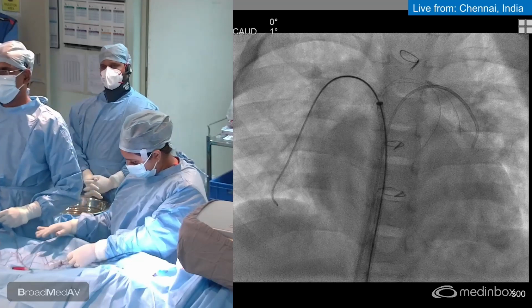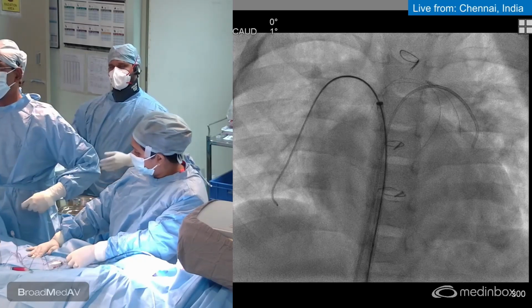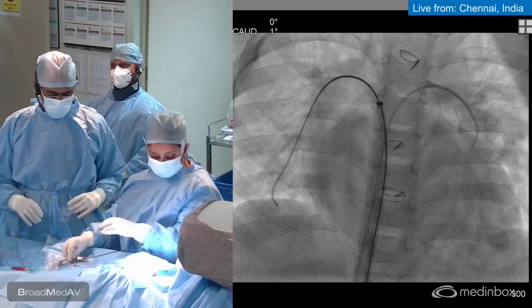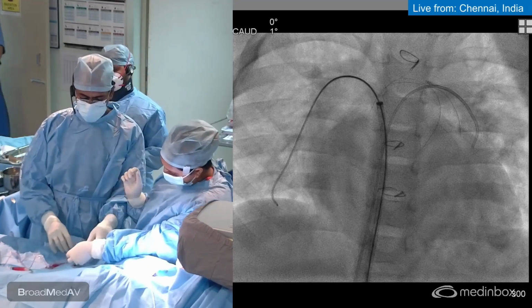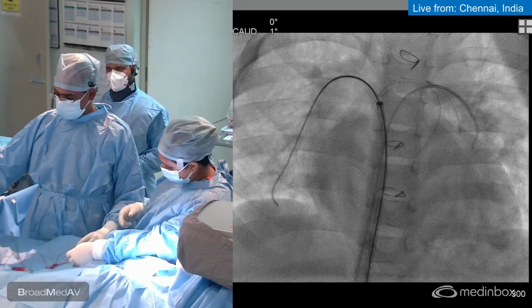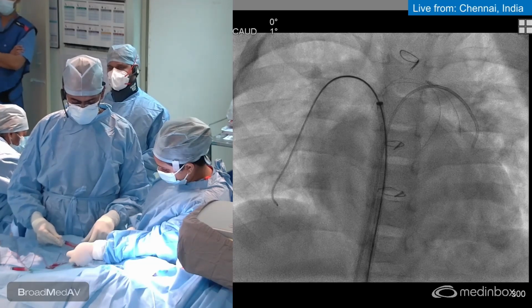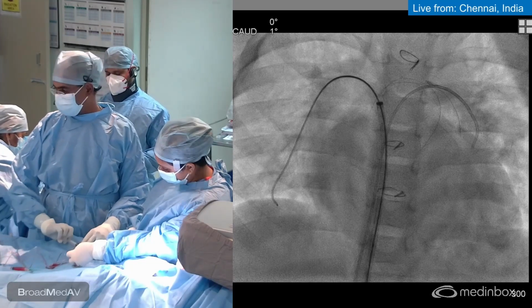Regarding the angiographic projections, we know that in this case the confluence is safe, the confluence is not having significant narrowing. If the confluence was also narrowed, what kind of angiograms would show it better, including the branch case in these cases? One of the challenges that we'll face in the presence of a confluence narrowing in a setting of an arterial switch operation is that the confluence will be narrowed anteroposteriorly, so it's going to be difficult in visualizing the confluence very clearly.